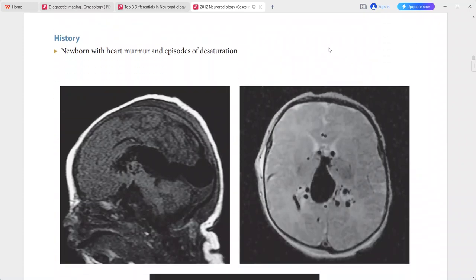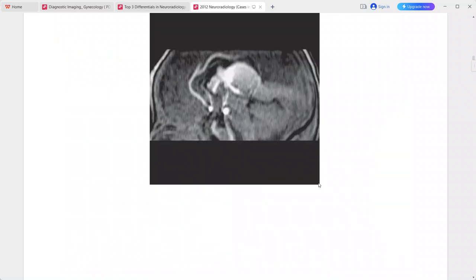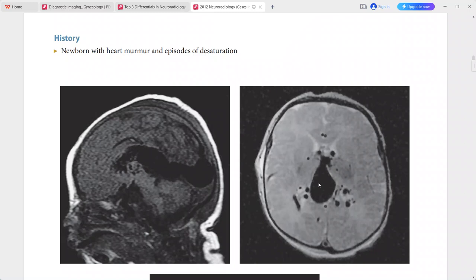Next case: newborn with heart murmur and episodes of desaturation. Sagittal T1-weighted MRI and axial T2-weighted MRI show a large flow void along the expected location of the internal cerebral vein and vein of Galen. The aneurysmal veins are continuous with the median vein of the prosencephalon, and there is no visible straight sinus.